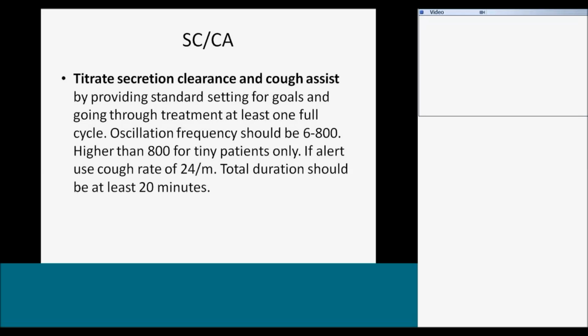As I said previously, I like a cough rate of 24 per minute, just because graphically, when the full screen is up there, you've gotten rid of the setting choices and the alarm settings. They're off the screen. At that width, the sweep puts one cough on top of the previous cough at the same point in the graph, so the patient is able to learn and determine when to place their own cough effort. And 24 a minute just really works well for me.